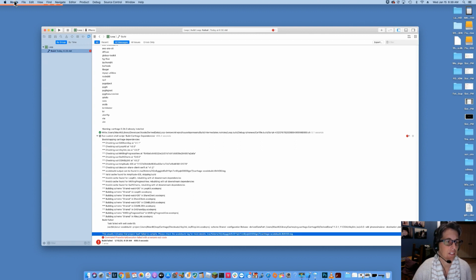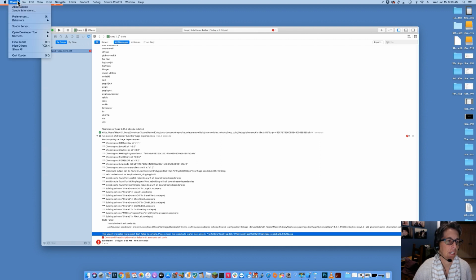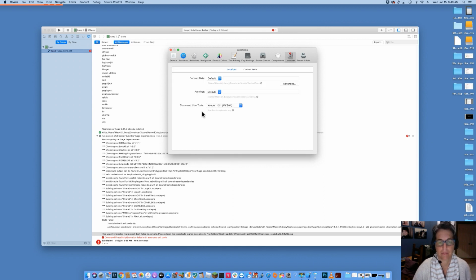The first thing I do is I always go and I check my about Xcode, make sure that it's current. 11.3.1, yep, that's current. I look for my preferences to make sure command line tools are installed with all of the updates for Xcode. Sometimes that gets left off. Yes, it is. It's there.